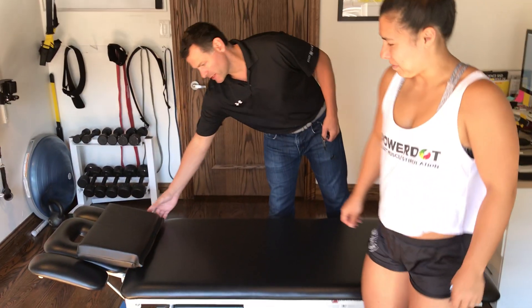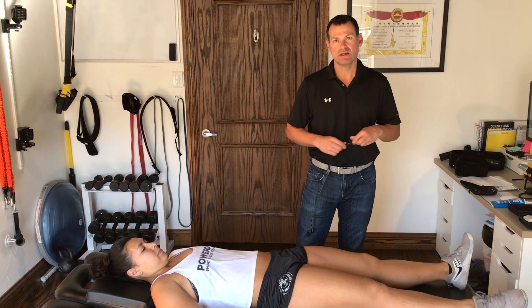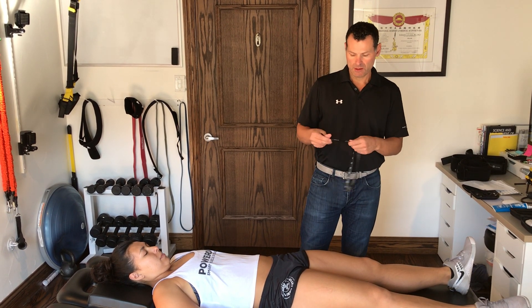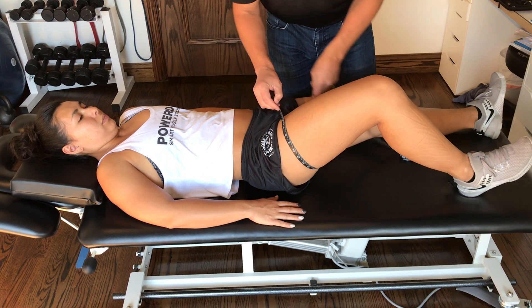I'm going to bring Emily out here. She's going to come into a supine position — I'm going to lay her on her back — and the first thing I'm going to do is figure out what size cuff I need, so I'm going to take a measurement right below her greater trochanter.